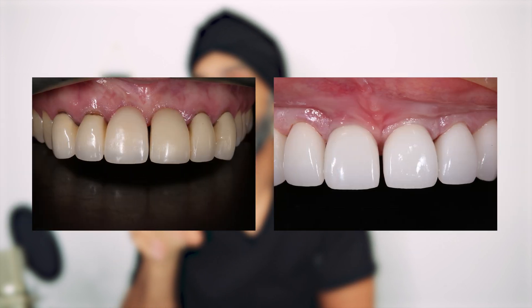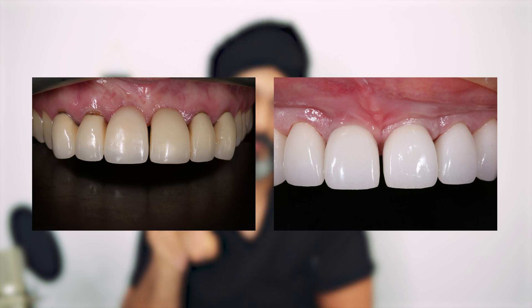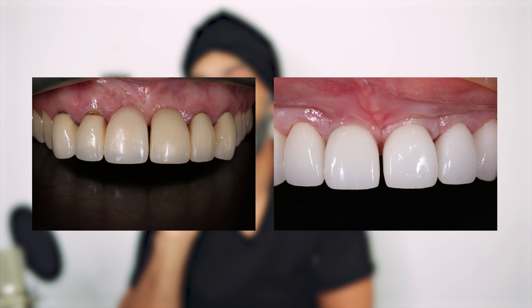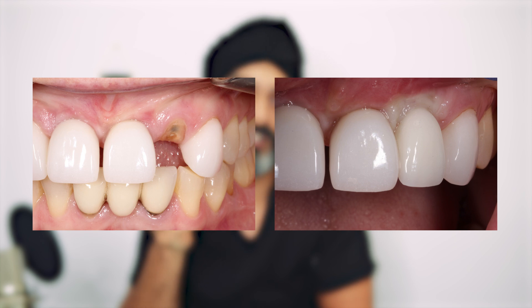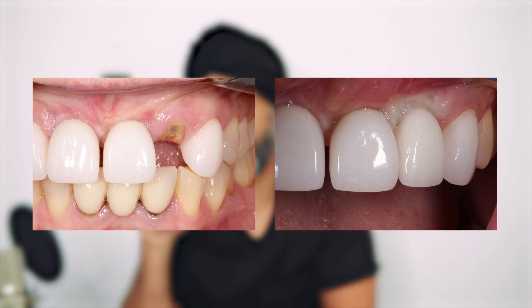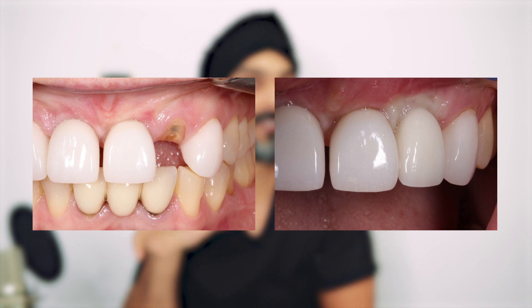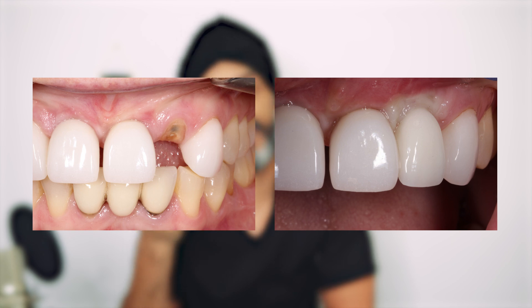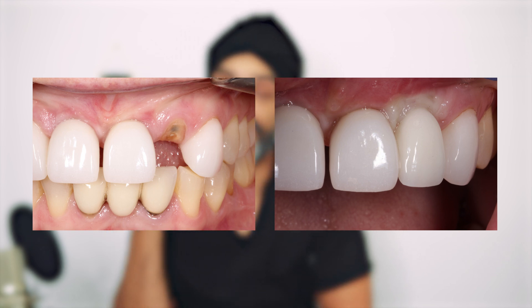In this case, we can see the front two teeth here are implants. What happened was she actually lost the tooth next door as well, so we've got three implants here all next to each other. Typically these pink triangles in between the teeth — the papillae — are very difficult to get. But using these techniques, using connective tissue grafts, we are able to get really good looking end results.